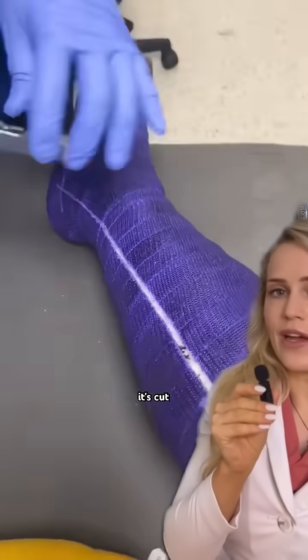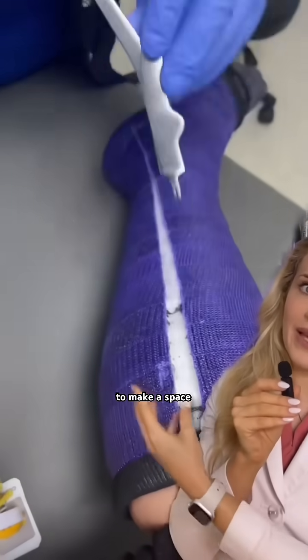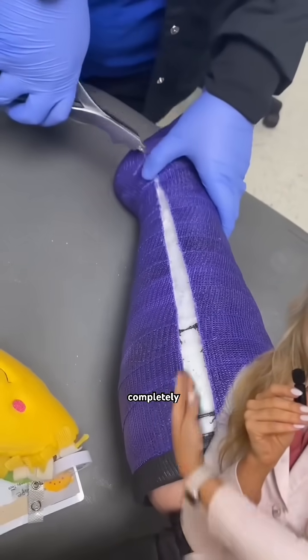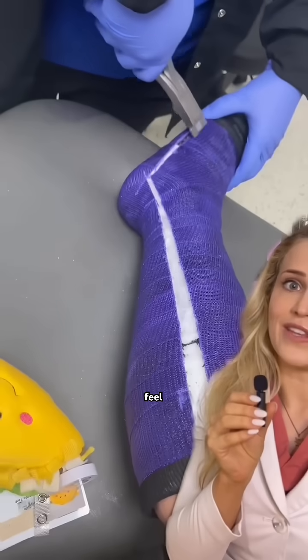Once it's cut all the way through the cast, you're going to use this separator to make a space to allow the scissors to go through so you can cut the cast completely off. Getting it off must feel amazing.